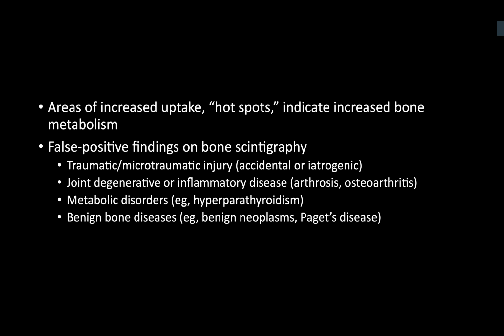Exactly. So that is one of the important points, because there are certain false positive findings in bone scan. One of them is rib fracture. Can you tell me other conditions which can cause false positive findings in bone scintigraphy? Especially in those cases, we can use a SPECT CT. So Paget's disease could also, and bone islands could sometimes be misinterpreted as hotspots.